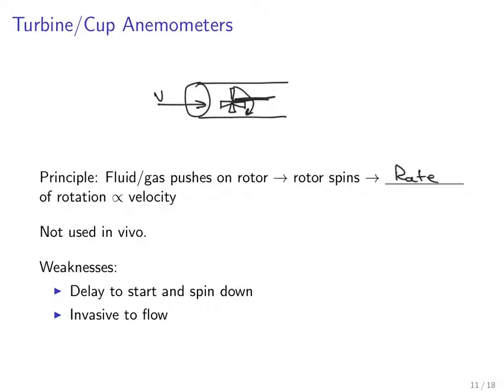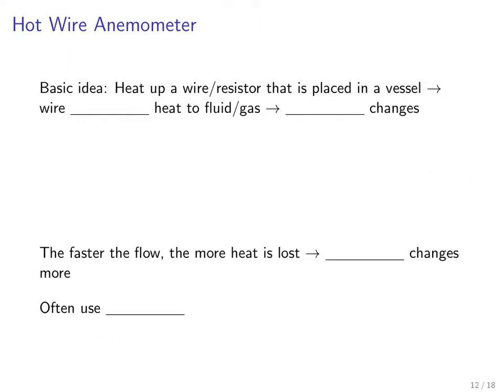Of course, these devices are not used in vivo because you have to stick them into a vessel. Weaknesses are that they have a delay to start up or spin down, so they don't have a super fast time response, and they are also invasive to flow, as I said.